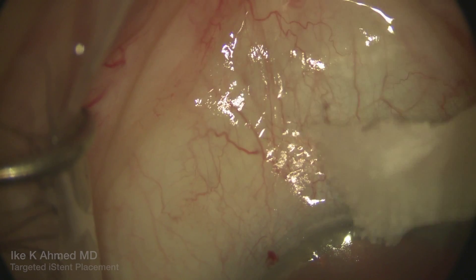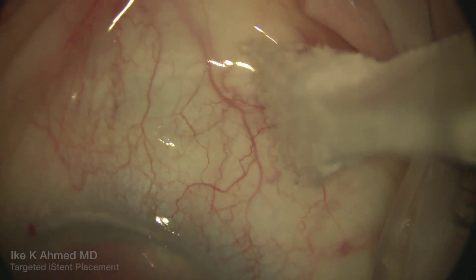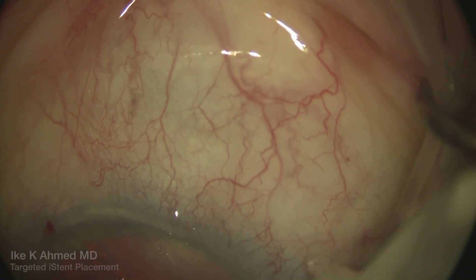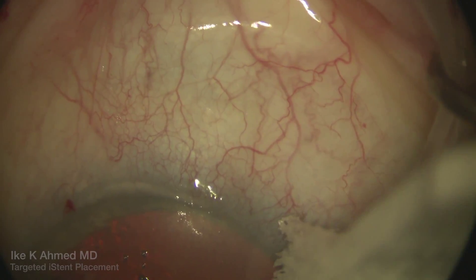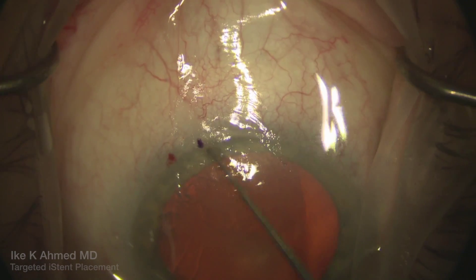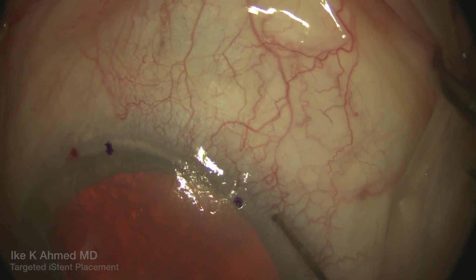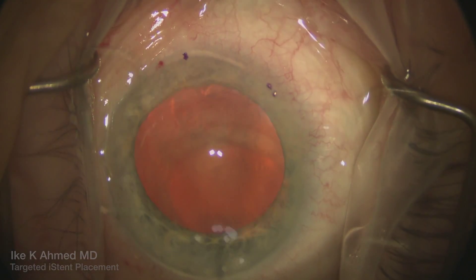Here we're identifying the position of the aqueous vein near the canal itself. Supernasally, we identify a large aqueous vein with a couple of small branches that meet up to form it, identifying where they seem to enter the middle limbus at the canal position. We will then place ink spots where we feel these aqueous veins are positioned along the canal. There are typically four or five of these aqueous veins throughout the eye.